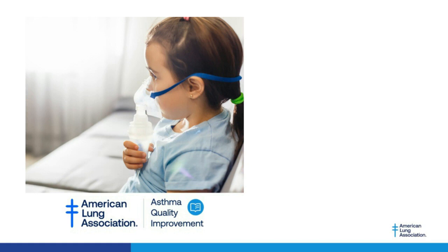So at the University of Minnesota we're using 21 days. We're also doing a research project looking at the lung. We're doing complete pulmonary function testing, bronchodilator reversal studies, and 6-minute walks on patients that have had COVID, to try to document what changes and how we're going to look at that particular lung disease, because the scans and my medical director suggest that there probably is some permanent damage in some of the patients that have had COVID. So we're trying to document that.